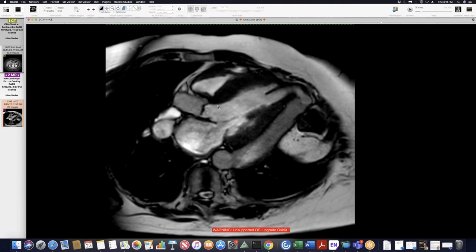But they started making them actually in the 50s, and they were doing them a lot in the 70s for congenital heart, where congenital LVOT obstruction. The outcomes for that weren't really good, and that eventually got replaced by the Ross procedure. And so at this point, these are just used once in a while for basically really severe aortic stenosis where the patients are not surgical candidates, like this case. But it's not a new device. It's just not used very commonly. Okay.